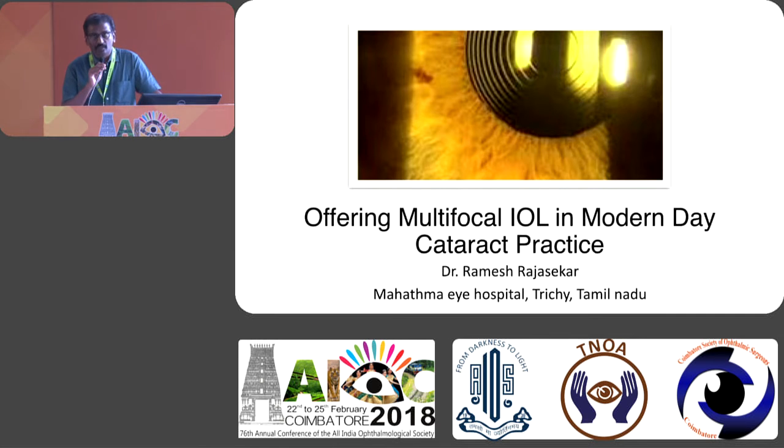Thank you, sir. We were seeing a good surgery and good unifocal lens implantation, and just coming to offering a multifocal lens implantation. We all have been good surgeons, doing good unifocal lens implantation procedures, but we never felt the need of the patient.